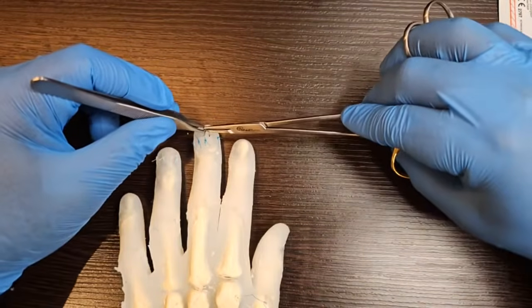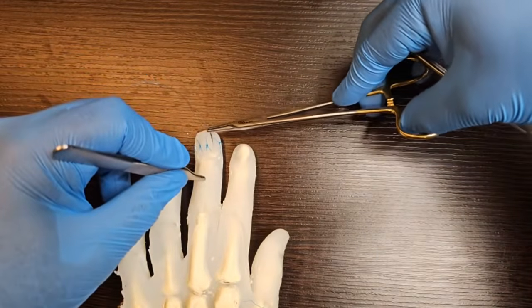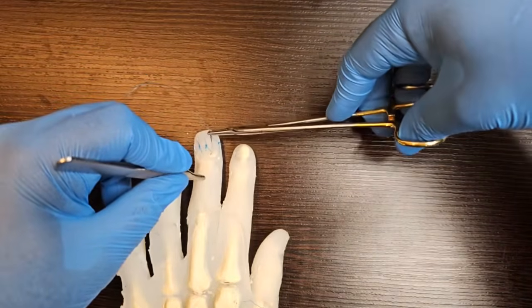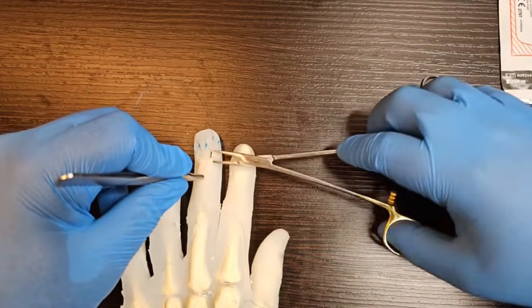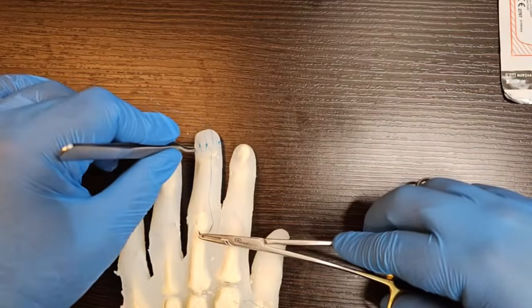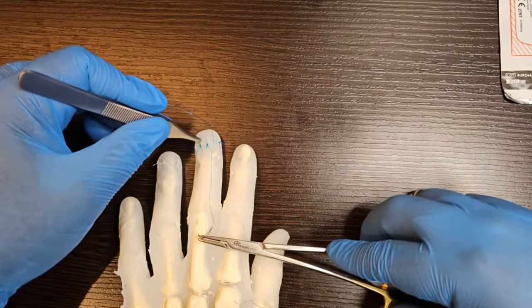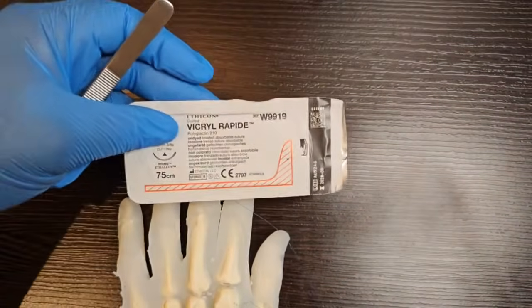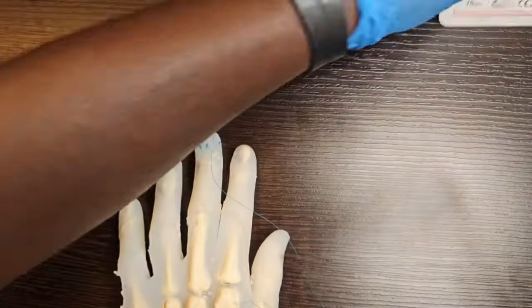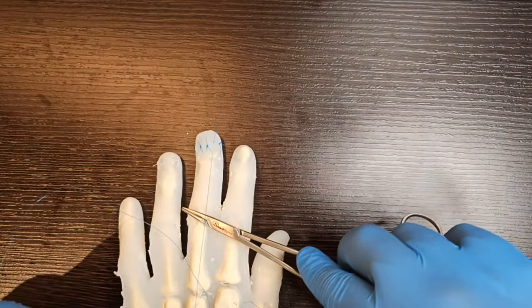So this is a sterile matrix laceration through the middle finger. There was no underlying fracture. It involved the paronychium. It did not involve the eponychium. It did not involve the hyponychium. I would typically use a dissolvable suture. I showed you an example, Vicrorapide. I would use a 5/0 Vicrorapide for this, using this dyed suture so you can just see the placement.